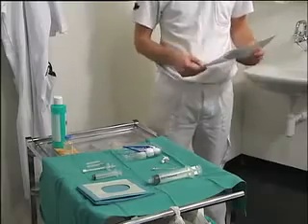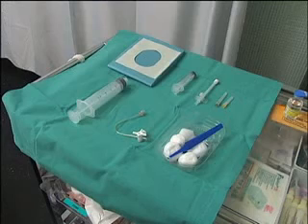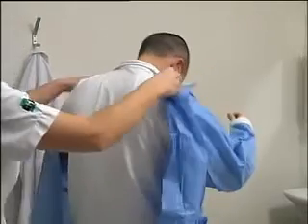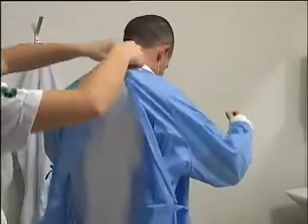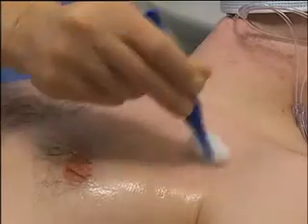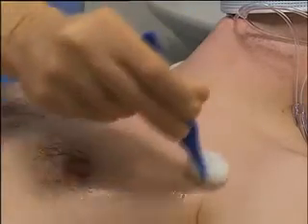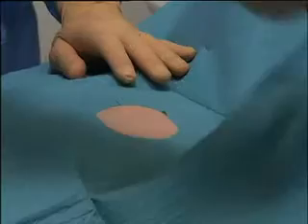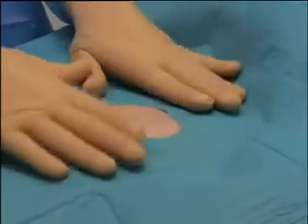Use a checklist to make sure that all the necessary equipment and supplies are ready for use and within easy reach. Put on a face mask, a protective or sterile gown, and sterile gloves. Use chlorhexidine or another antiseptic solution to clean the patient's skin in the area where the aspiration will be performed. And position the sterile drape.